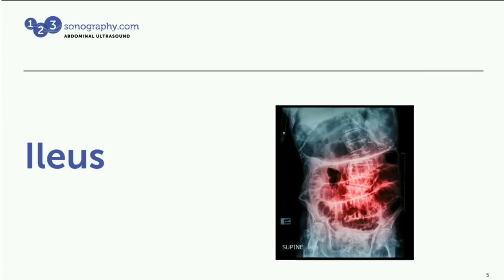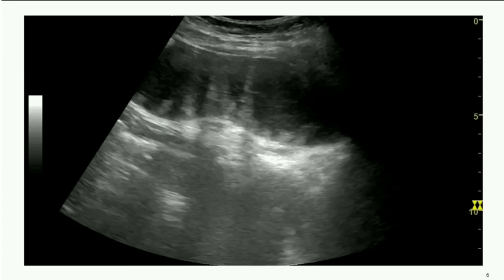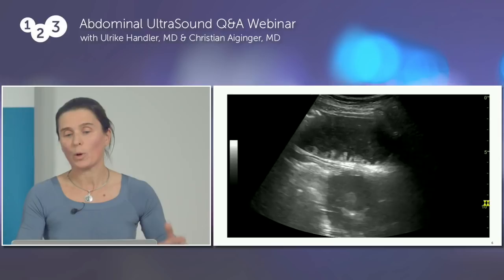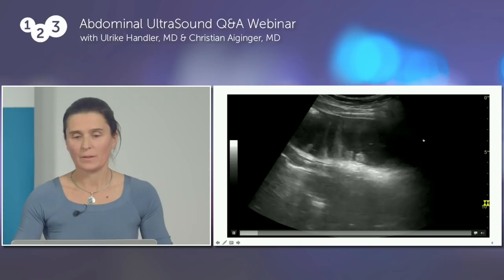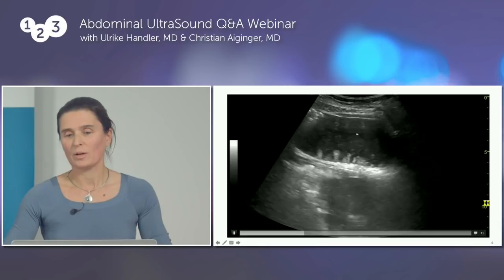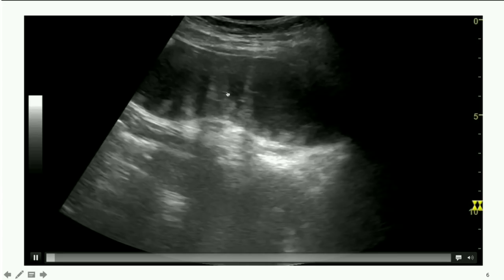Now let's see what an ileus looks like. Comparing to the previous normal healthy bowel loops, this one is really dilated. The normal cutoff is up to 2.5 centimeters; here we are estimating about 4 centimeters or even more — at least double the size. You can also see the fluid-filled content.